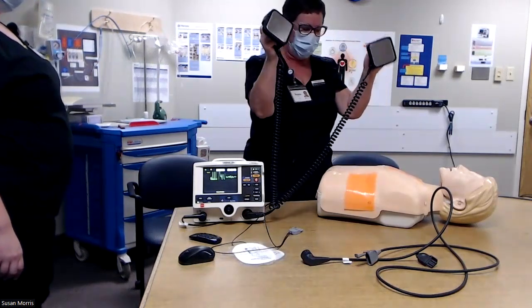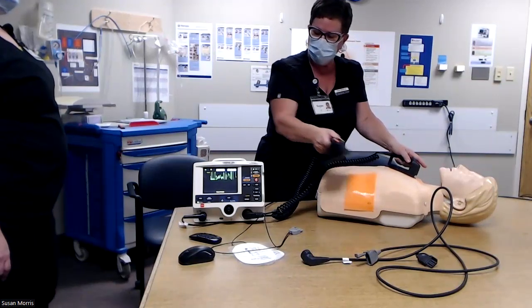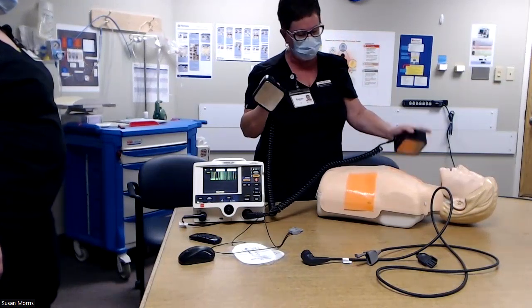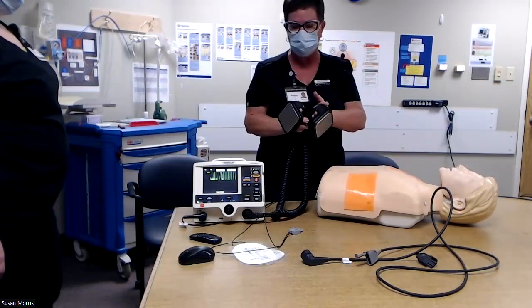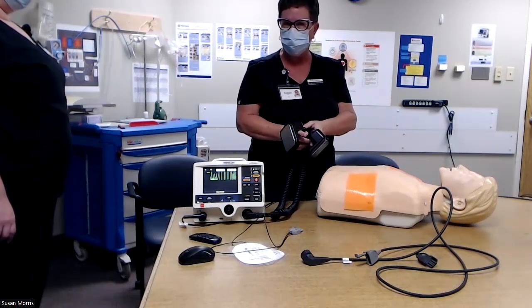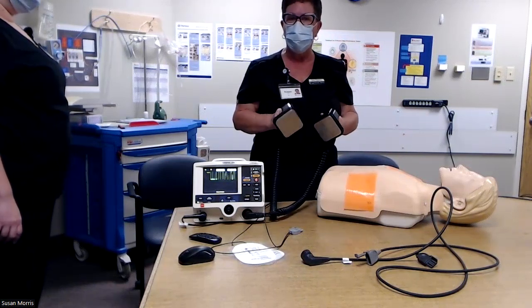Remember that when you place these on the patient's chest, you will get a rhythm up here on the monitor. That is how you will see what the rhythm looks like. You do not need to put your ECG electrodes on when your patient has no pulse.